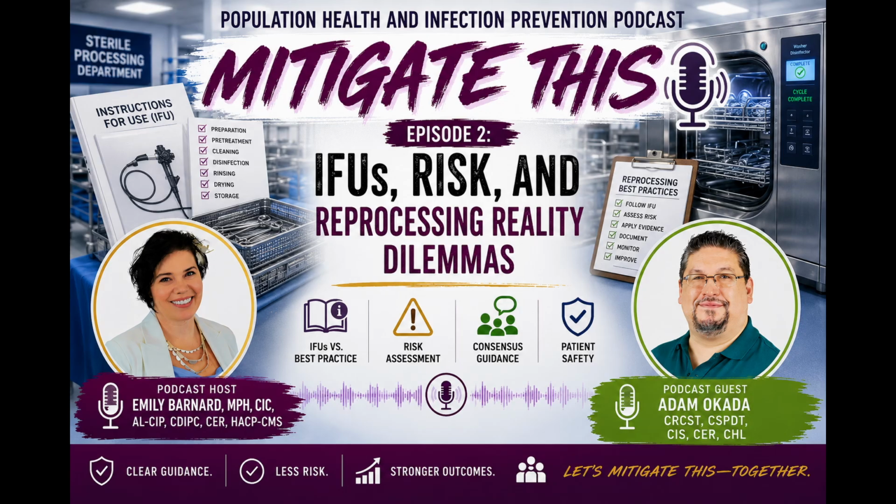Again, publicly searchable. It's a great resource for people if you're concerned about a device or you want to see, is this device safe if they're going to bring it in? I would recommend learning how to use that system because it is complex. You can't just type in the name of your device and assume that things are going to come up. You actually do need to learn. There's like seven or eight different drop-down menus. You've got to learn which one your device will be in.